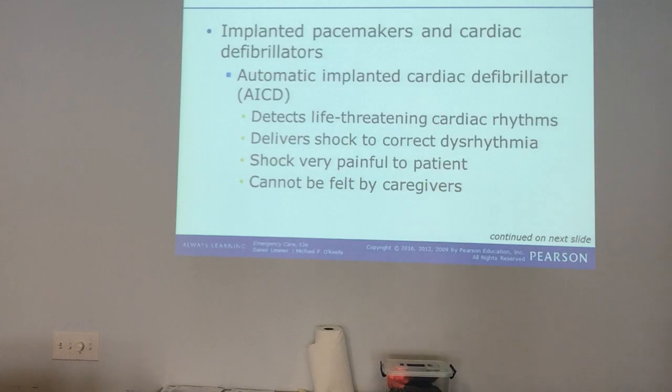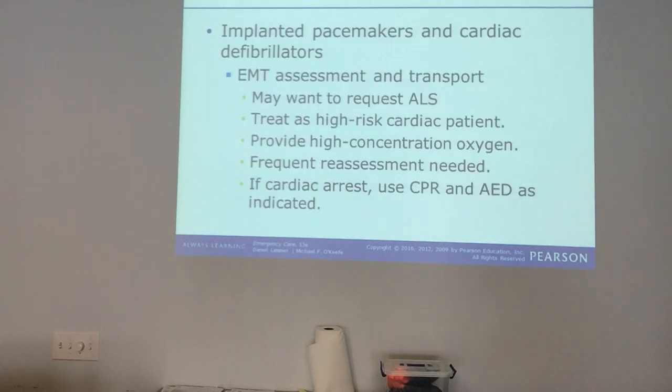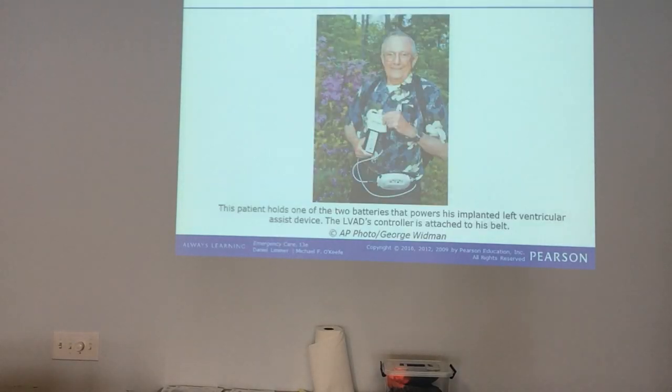And that's kind of true, except for when they're in cardiac arrest and it shocks them and their arm comes up and hits you in the face, which has happened to me, or hits somebody in an inappropriate place. That hurts, and it does happen. So, if these are going off, we will want to request ALS, treat as a high-risk cardiac patient, provide high concentration oxygen, frequently reassess, be ready, have your pads on. If cardiac arrest, use CPR and AED as indicated.